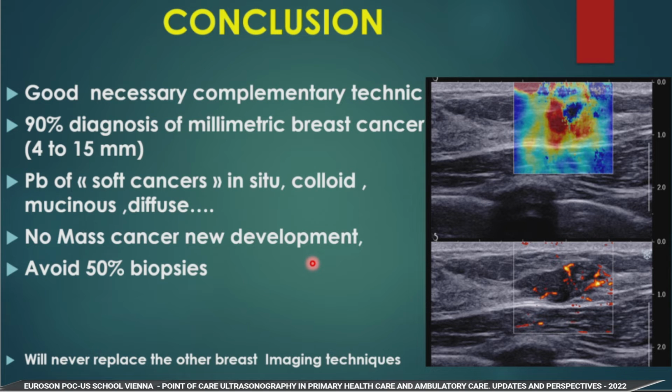So my conclusion, today I cannot imagine making a diagnosis of a breast tumor without elastography. It's a good, necessary, complementary technique. In my experience, I can do the diagnosis of 90% of the minimal breast cancer.